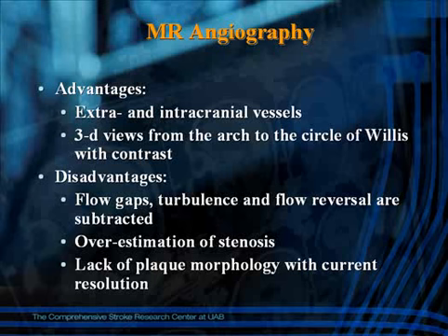In short, we order MRA if we order MRI all the time as part of the package, and because of the frequency of artifacts or false positive lesion visualization on MRA, quite often magnetic resonance angiography generates another referral for ultrasound testing, just to double check if the flow gap or flow absence in a certain vessel does represent a significant lesion or is an artifact. So in a sense, MRA and ultrasound, carotid and intracranial ultrasound, are very complementary to each other.